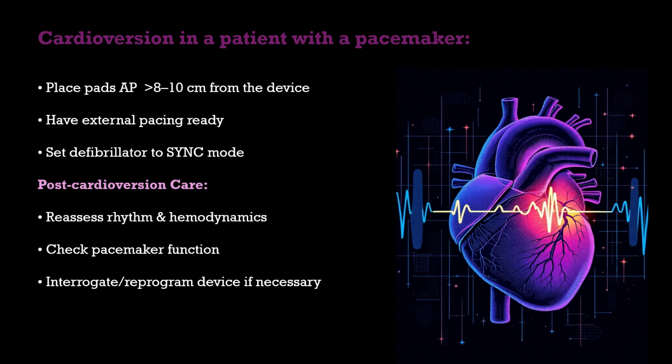A very important hint: for the ICD and CRT-D, we have defibrillator function, so there is no need for external cardioversion. But if the device is not working properly, we need a magnet to stop the device and cardiovert the patient externally, and then check and reprogram the device after the emergency condition.